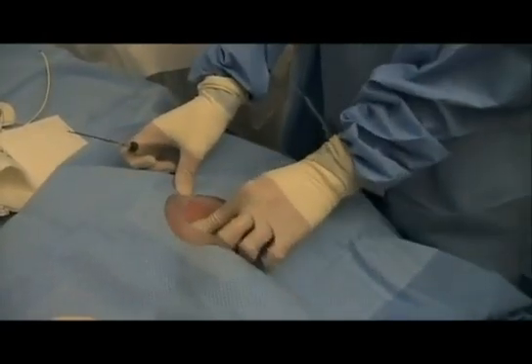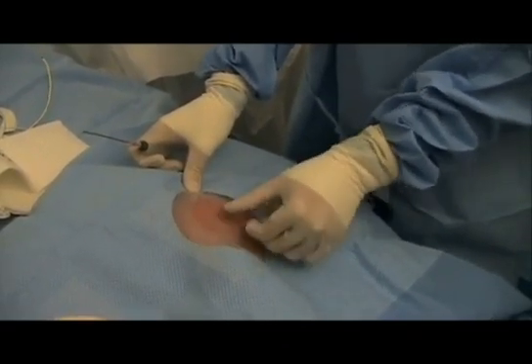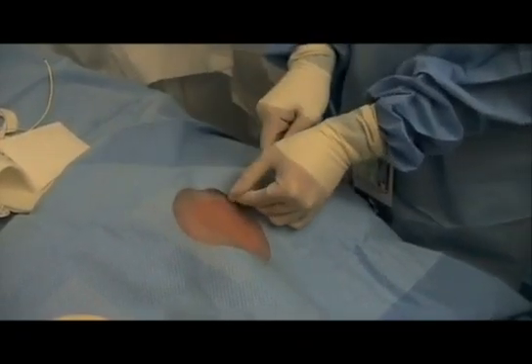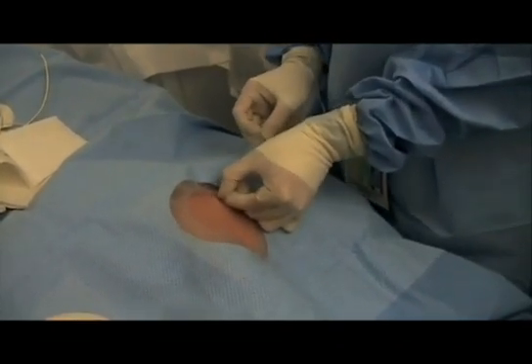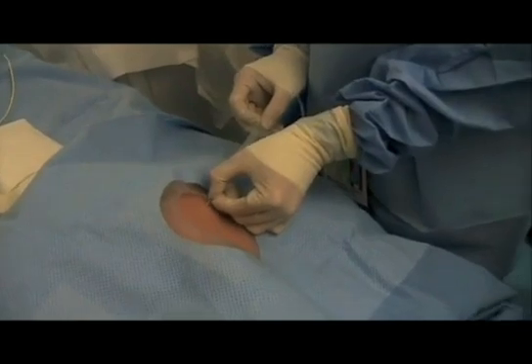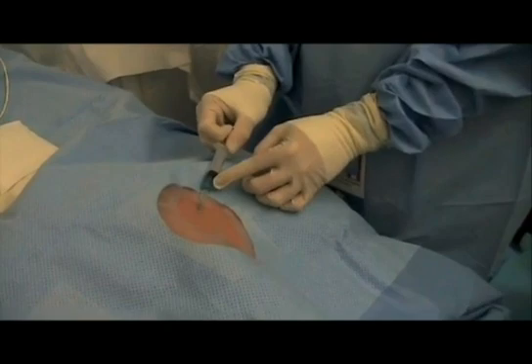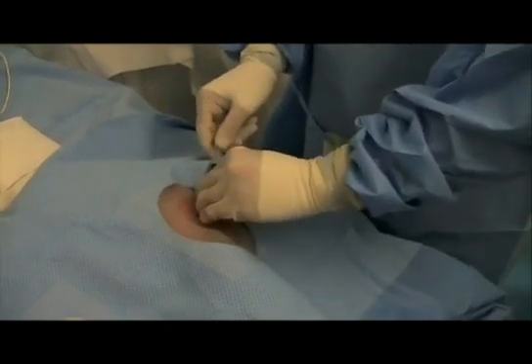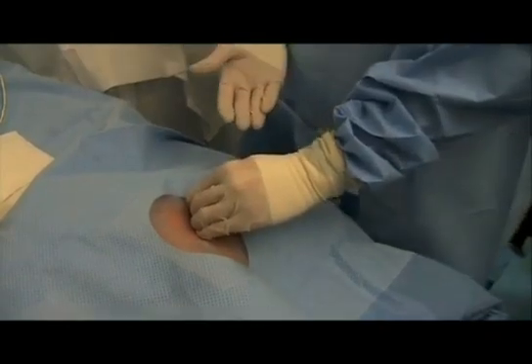If you try it the correct way — coming in straight where the clavicle transitions to the diagonal — start a centimeter away at the skin, puncture and hit the bone right there, then go underneath, sometimes having to hub the needle, and you'll get your flash. At that point take your syringe off, hold your needle with your finger over the hole, get your wire, and finish the procedure.